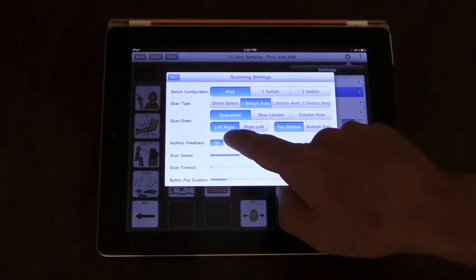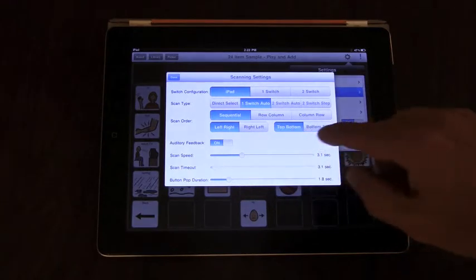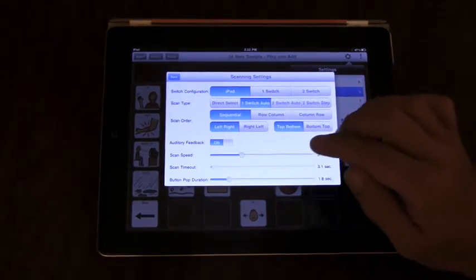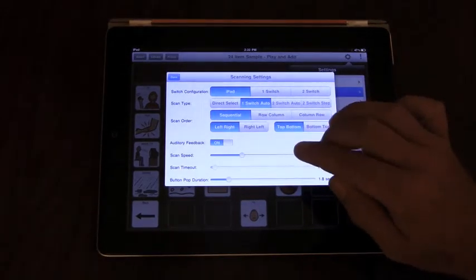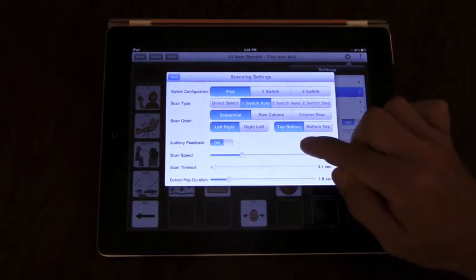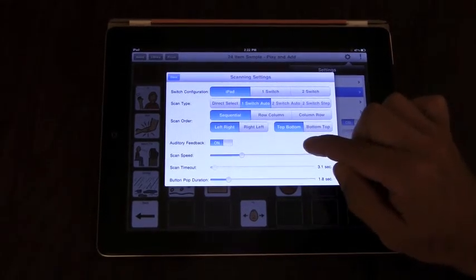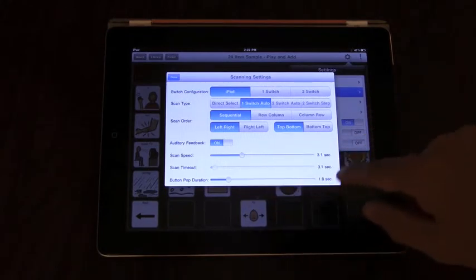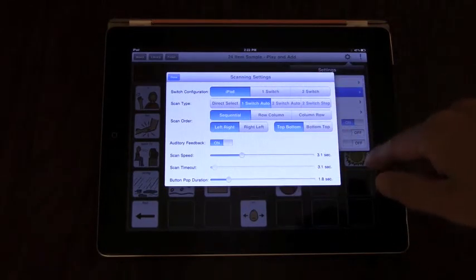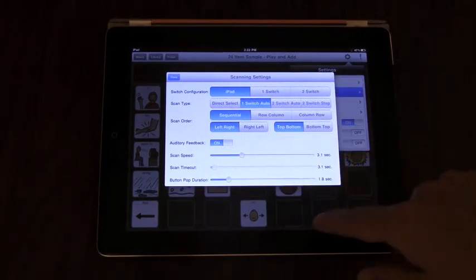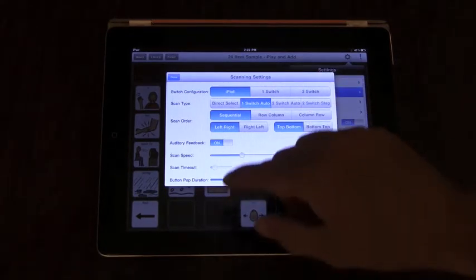Auditory feedback is a text or recording that's separate from the spoken text or recording so that you can have a separate message to feedback while scanning.